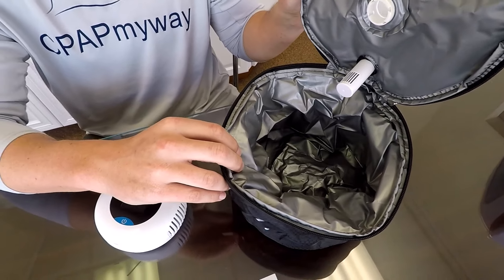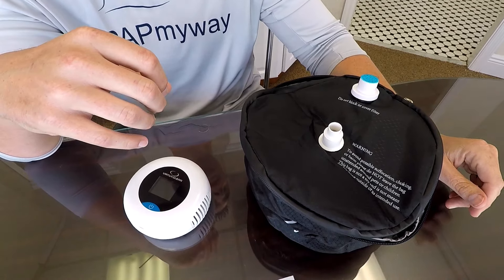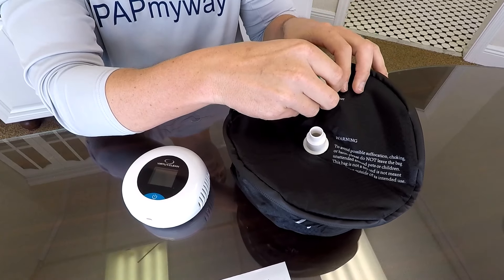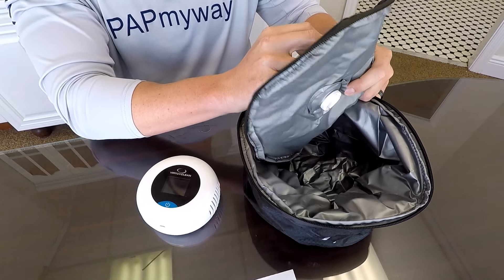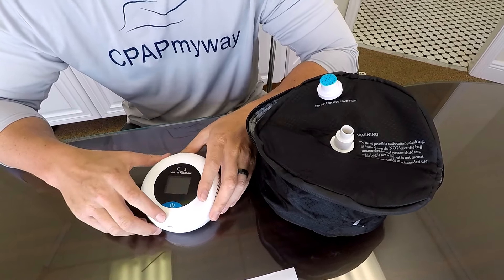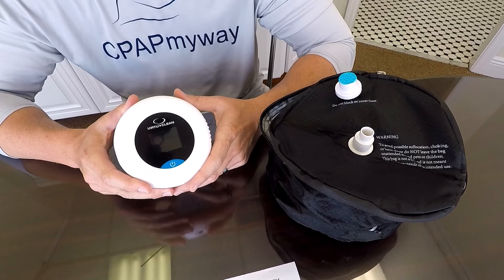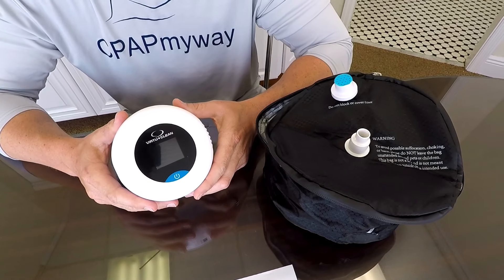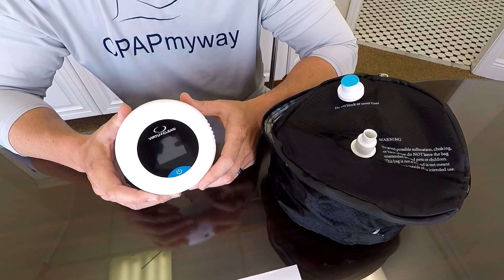It comes with a sterile bag big enough to fit your mask, tubing, and humidifier chamber. Just like the Sleep 8, you're not getting any ozone into the actual CPAP machine, which is an important thing to consider. The only replacement part is one filter that slides in and out of the bag — you need to replace it about every six months. There are no adapters needed for this unit, so even on heated tubing you have no issue. It does come with one standard adapter that will fit any tubing. This device is warranted for a full two years.